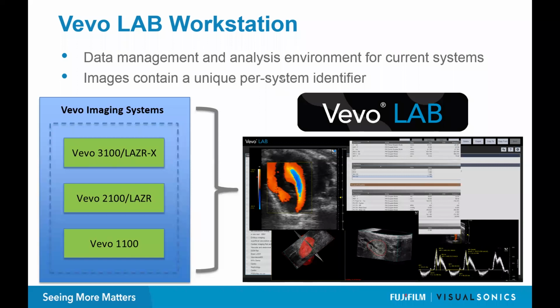Great. So I wanted to just highlight really quickly, I mentioned a couple of times the Vevo LAB Workstation. So Vevo LAB Workstation software is a separate piece of software that's available to work with the imaging data.